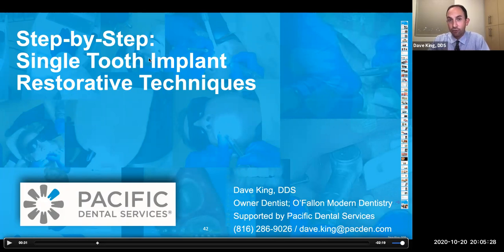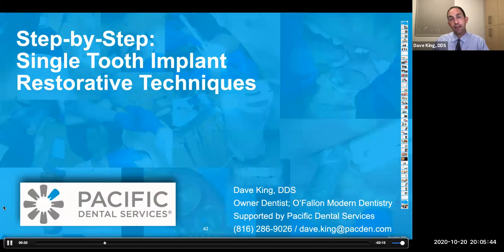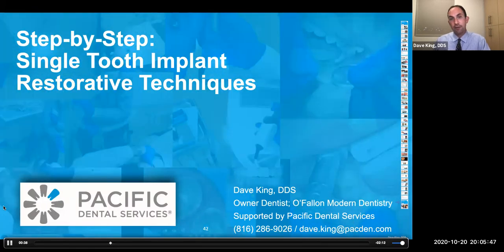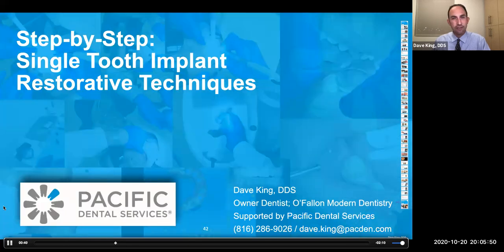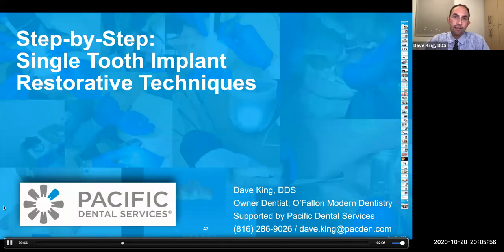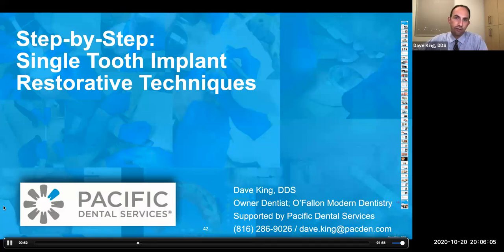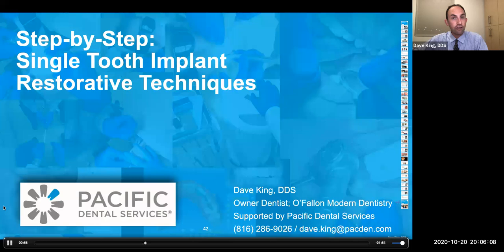Otherwise, like I said, you risk some sort of flexing over time and fracturing the implant, either the abutment or screw loosening. Incidentally, there are a bunch of studies out there that talk about how the implant itself won't fail necessarily, or the abutment won't fail usually. It's the screw that'll loosen and fail, because that's the weakest link, unless you've designed your implant restoration too thin or it's manufactured too thin. So yeah, we have to be real cautious to control all those factors. And when you have implants that are butted together, then the whole playing field changes. And we can manage those excursive and protrusive interferences with a little more control on the implants because they're connected in more than one plane.